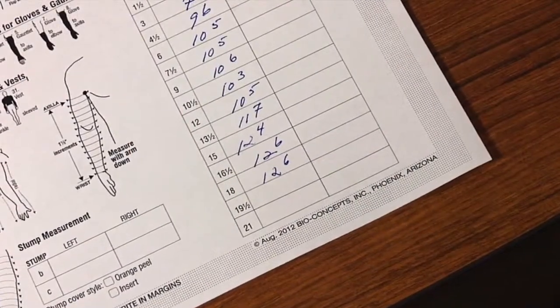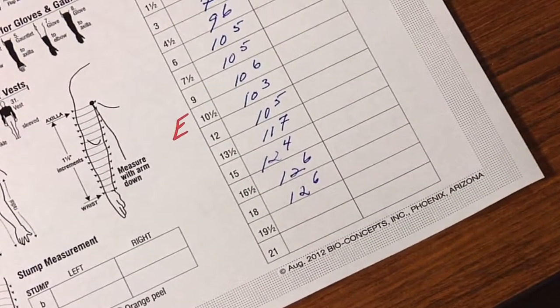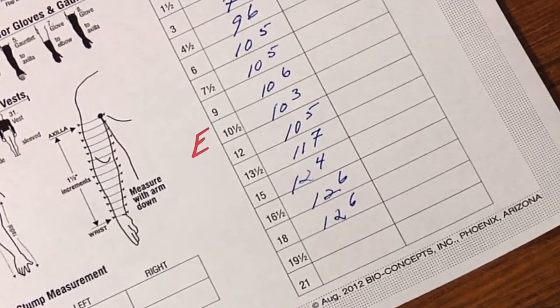If the sleeve is to go over the elbow, record the location of the elbow by marking an E on the measurement chart, next to or between the circumferences closest to the elbow.